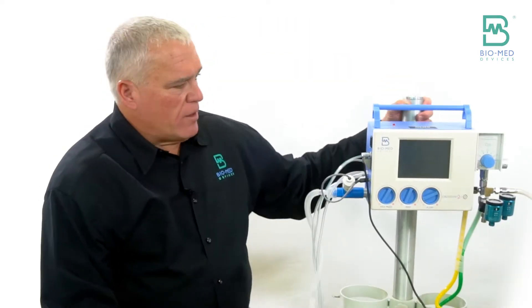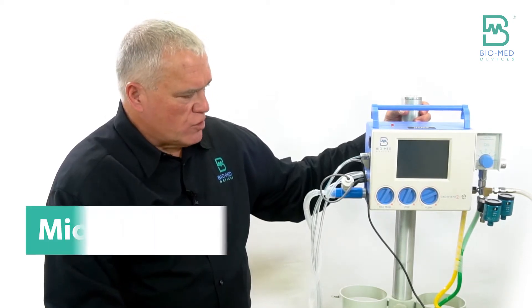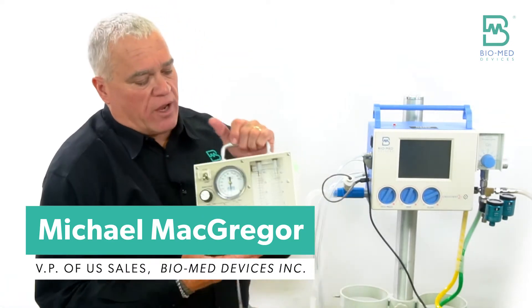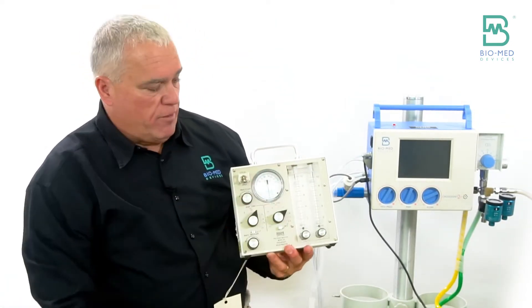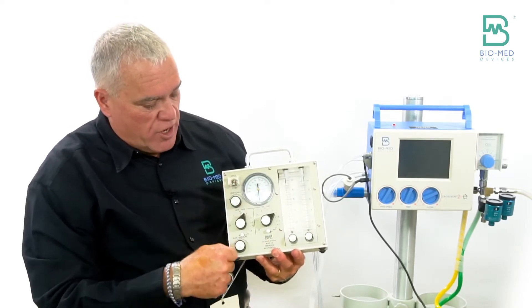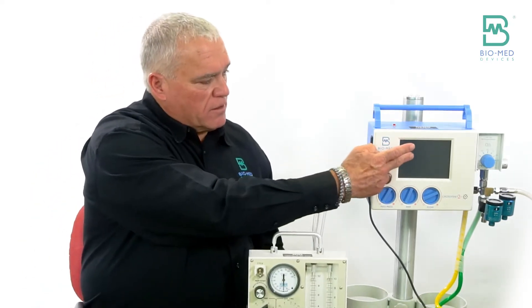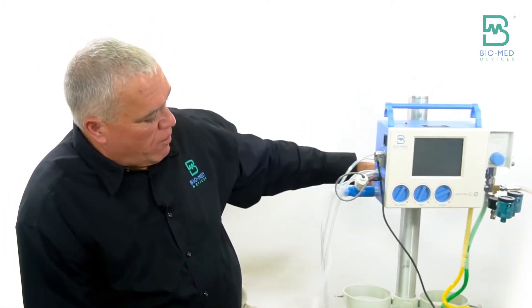I'd like to talk about the initial setup and some of the basic controls. I'm going to refer to this for people transitioning from the old MVP-10, where you had flow knobs, max pressure knobs, and PEEP knobs. This doesn't look anything like the MVP-10, but it's going to be very similar in how we set it up.